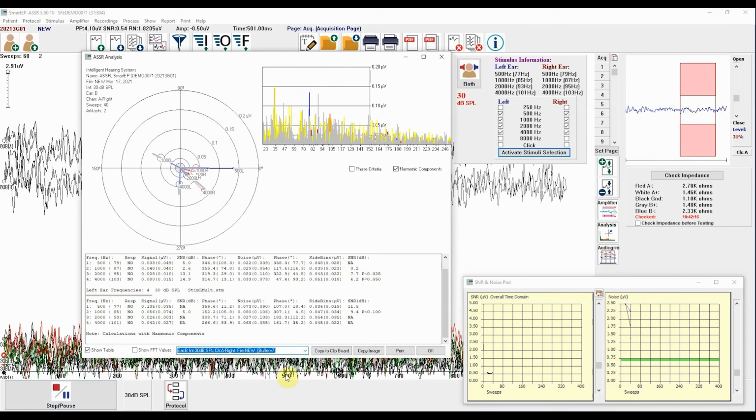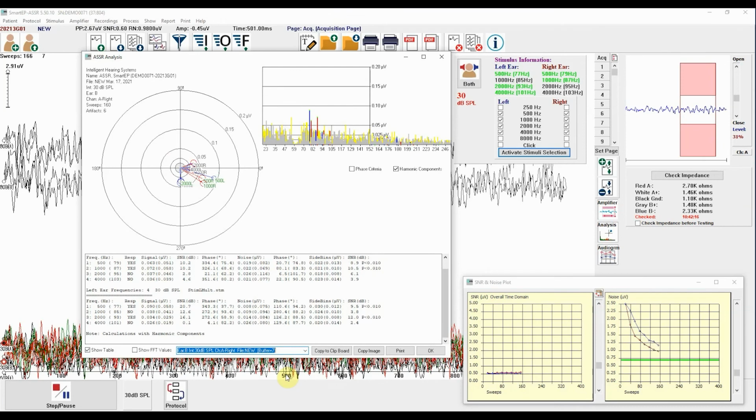You can also consider stopping your acquisition manually if you are at the end of your test session and you expect the patient to wake up and the patient's state to change, or if testing conditions change that are affecting the signal-to-noise ratios. If there's no response by 240 sweeps and the noise conditions are good, then you will probably not get a response if you continue averaging beyond 240 sweeps. Thus, stopping the test will increase your time efficiency.